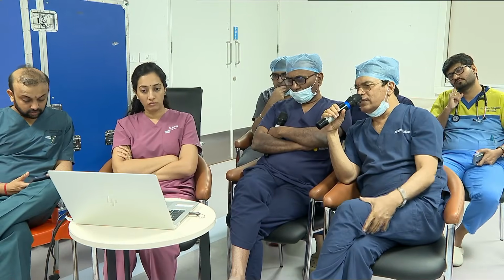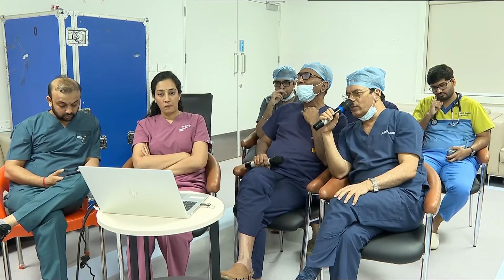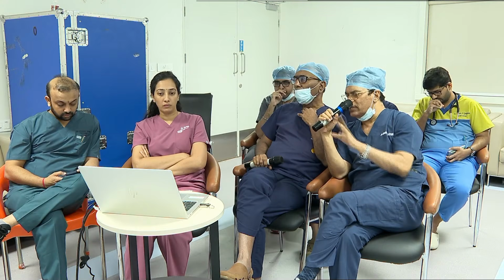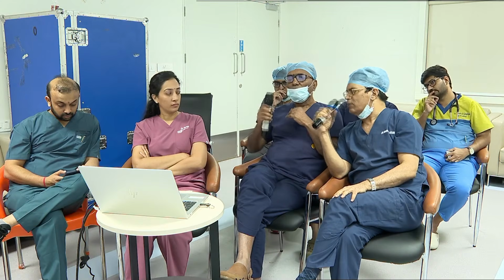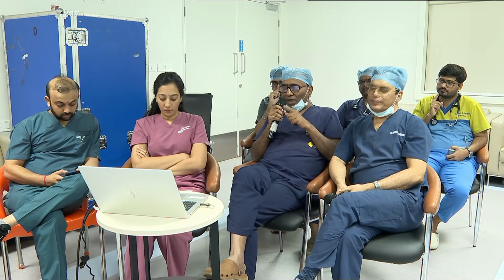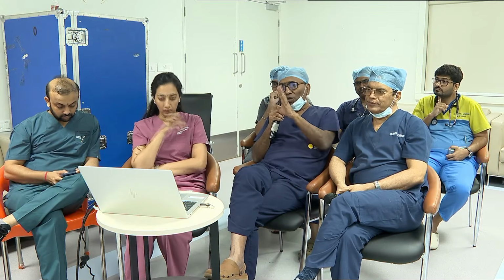But I think nicely done, very good device. It's like implanting a stent, but exactly keep the annulus there and implant. That timing of pacing and inflation time is also very, very crucial in managing these cases. Here, there are 2 issues. We are doing rapid ventricular pacing during deployment, and while removing the balloon also, it should be done under rapid ventricular pacing.